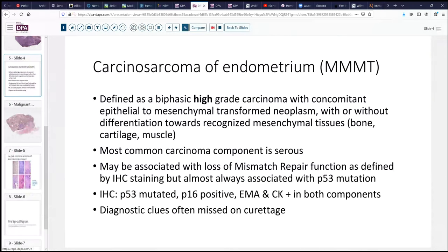Carcinosarcoma is a relatively uncommon disorder typically presenting in elderly women, although we have seen some cases in patients as young as their late 20s and early 30s. We have concomitant high-grade carcinoma — it's important to emphasize it's a high-grade carcinoma — with some sort of epithelial-mesenchymal transformed neoplasm which may or may not have heterologous differentiation into other mesenchymal tissues. Most commonly the carcinomatous element is serous, as in our case today, and these may be associated with loss of mismatch repair function by immunohistochemistry, but are almost always associated in both components with a p53 mutation. There will often be strong, blocky expression of p16.